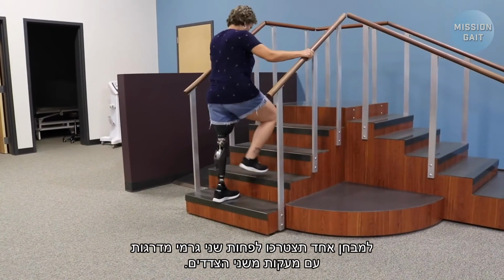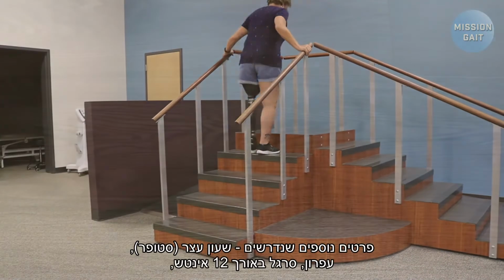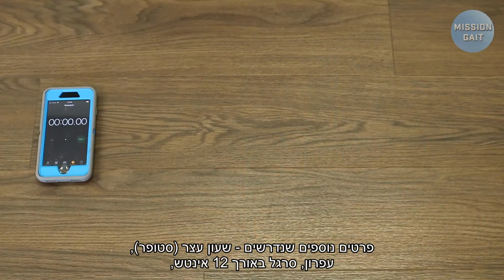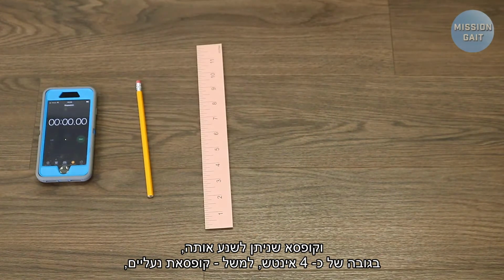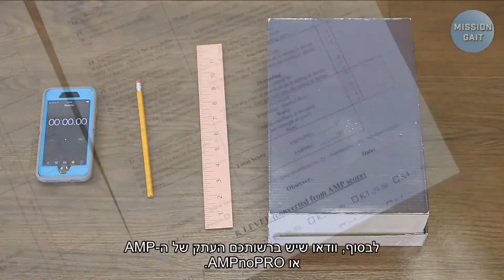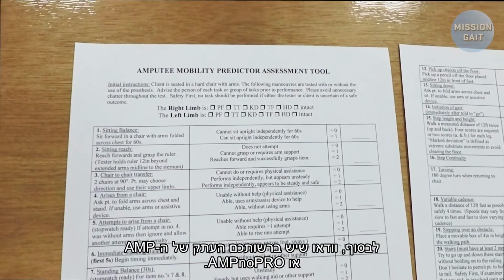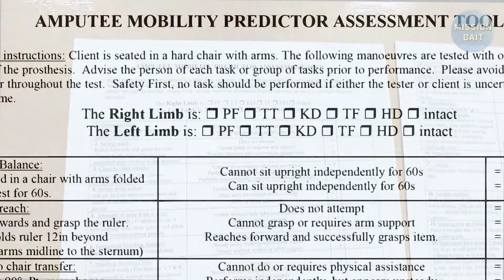For one test item, you will need at least 2 stairs with a rail on both sides. Other items needed include a stopwatch, a pencil, a 12-inch ruler, and a movable box, 4 inches in height, such as a shoebox. Finally, ensure that you have a copy of the AMP or AMP No Pro clinical instrument.